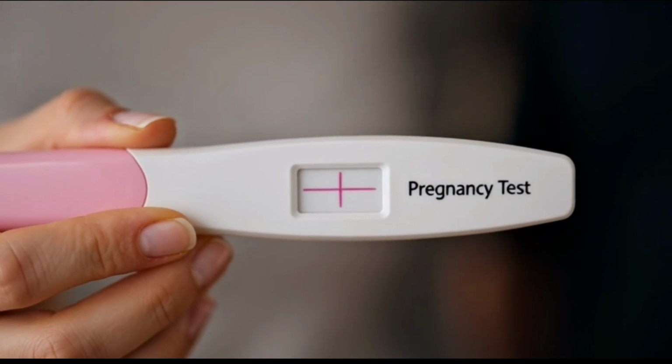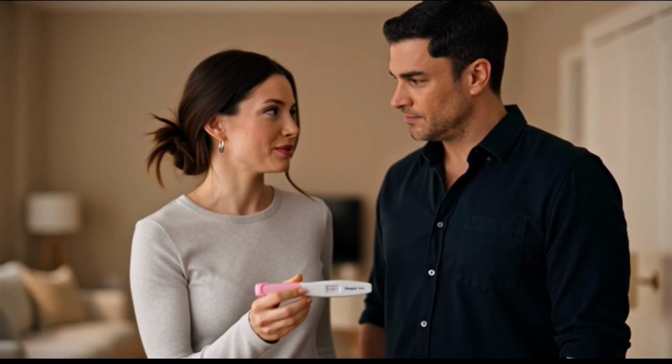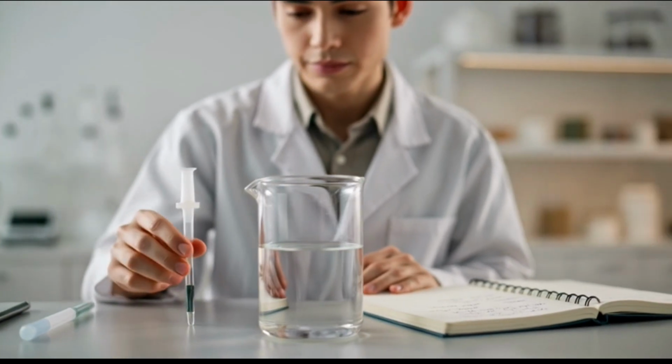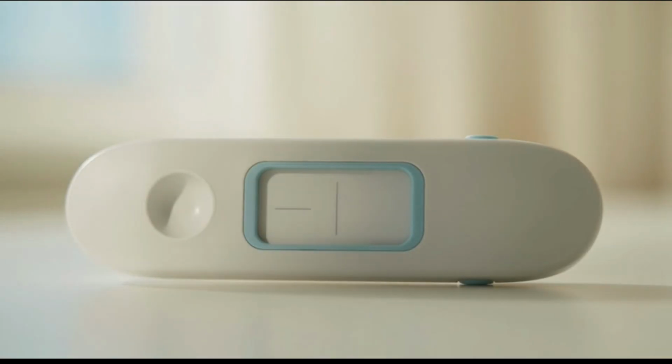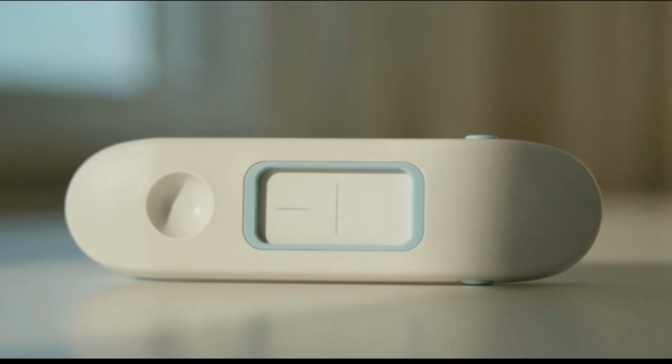If the second test is darker, that supports early pregnancy. If it's negative, it may have been very early testing, a chemical pregnancy, or simply an evaporation line. And all of those possibilities are more common than most people realize.